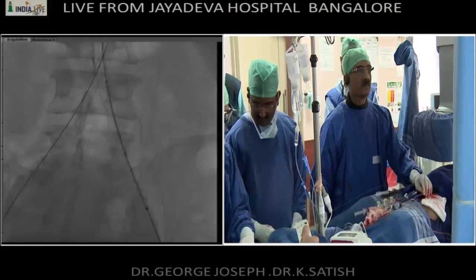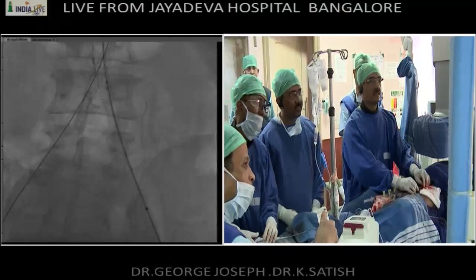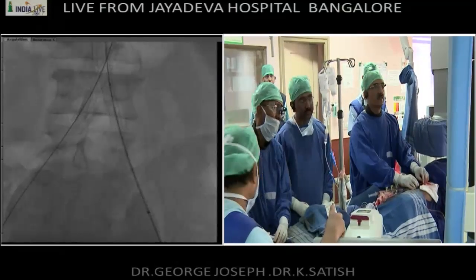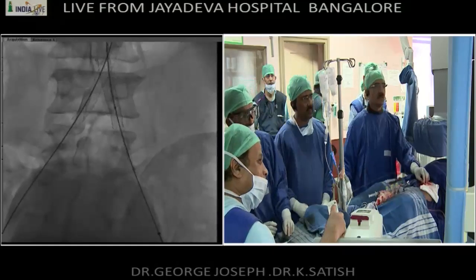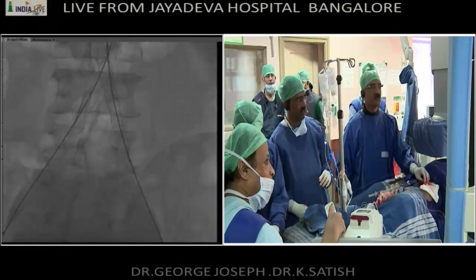It depends on the size of it. There is a limitation of the stent also. They can expand up to 2 millimeters beyond this. Yeah, it's good. Keep going, keep going. You can just deploy the whole thing. Yeah, okay. You can take the system out.